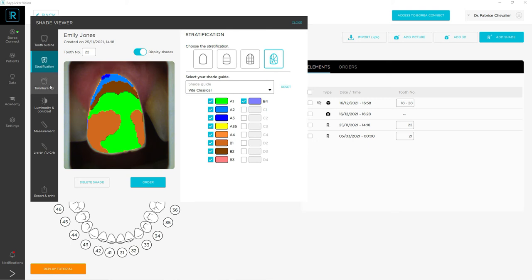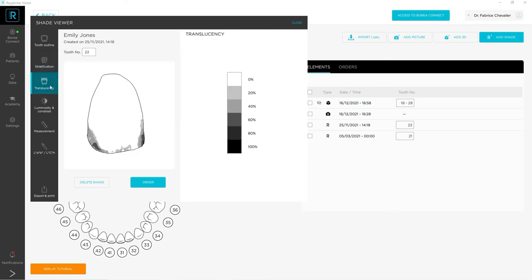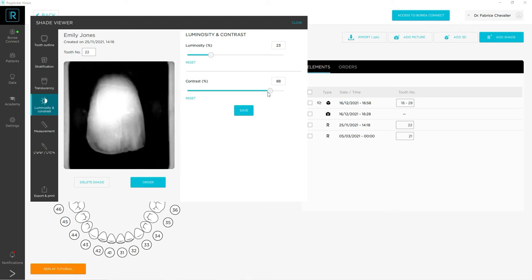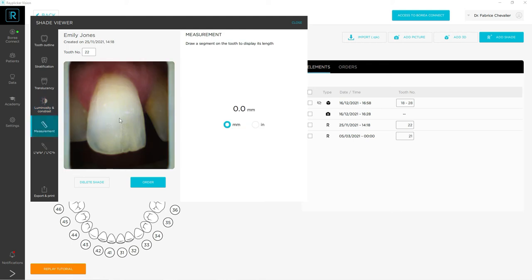Then you have the translucency mapping that regards you with the translucent parts of the tooth. The fourth button is the luminosity and contrast, which will help you to see some characteristics on the tooth. The fifth button, the measurement one, will give you approximately the measure of some characteristics in millimeters or inches.